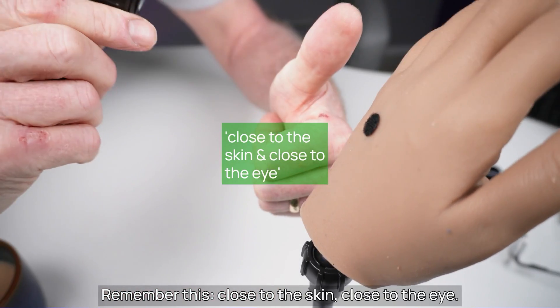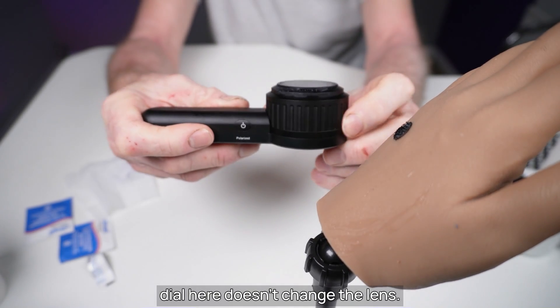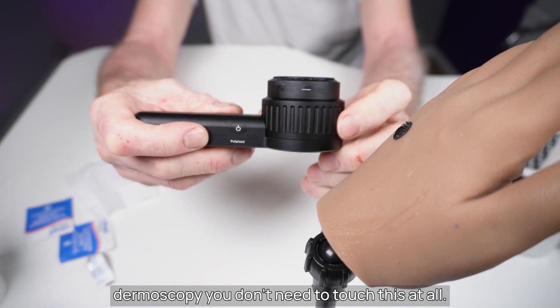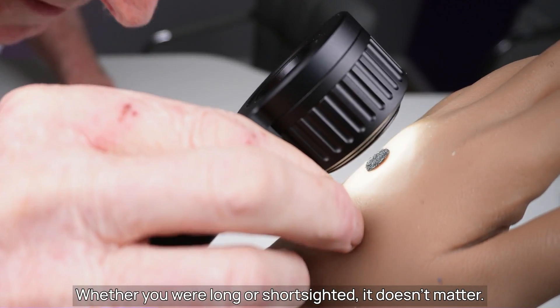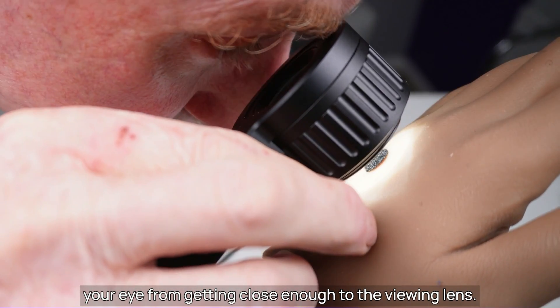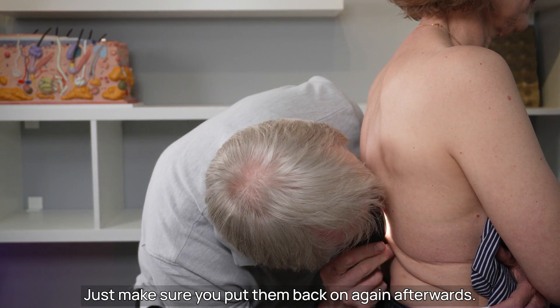Remember: close to the skin, close to the eye. On a hybrid dermoscope, turning this dial here doesn't change the lens. When performing non-contact polarised dermoscopy, you don't need to touch it at all. Mistake number nine: wearing glasses. Whether you are long or short sighted, it doesn't matter. You can take those glasses off if wearing them prevents your eye from getting close enough to the viewing lens. I always take my glasses off when using my dermoscope — just make sure you put them back on again afterwards.